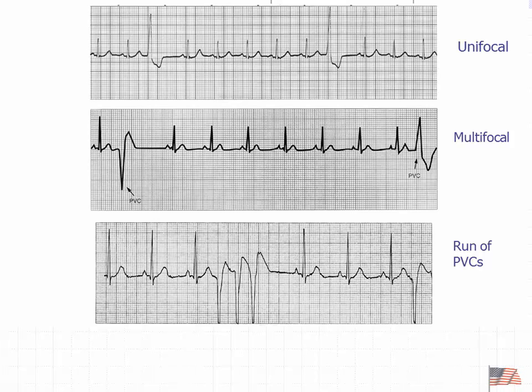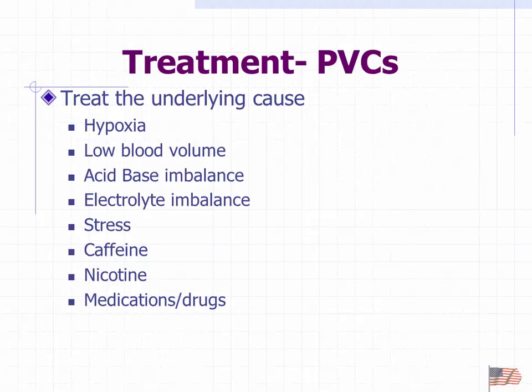Multifocal PVCs. Normal sinus rhythm with multifocal PVCs. Right? Little run of VTAC there. Just to get your underwear soiled. Because you look at that and you go, treatment, I won't worry about right now, but recognize that this could be life-threatening.